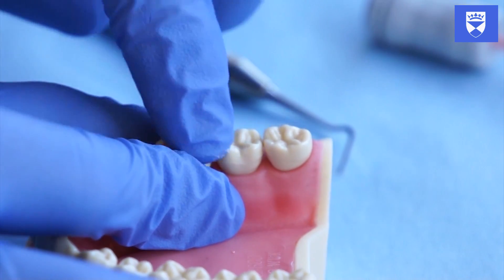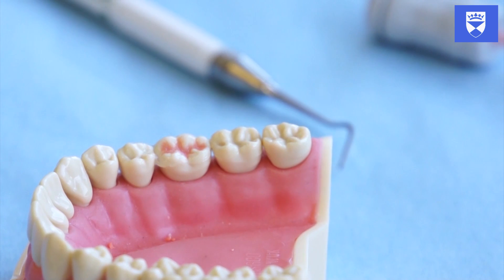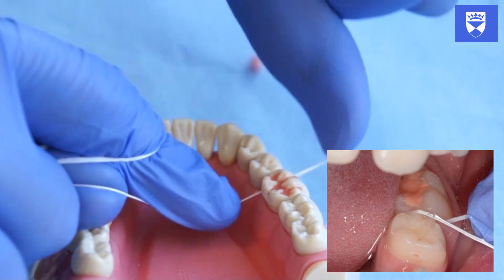When you are happy with the sealant, place petroleum jelly on the occlusal surface. This acts as a barrier against moisture and should cover the entire sealant. Finally, gently floss the adjacent contact points. This ensures that no glass ionomer has become stuck here.